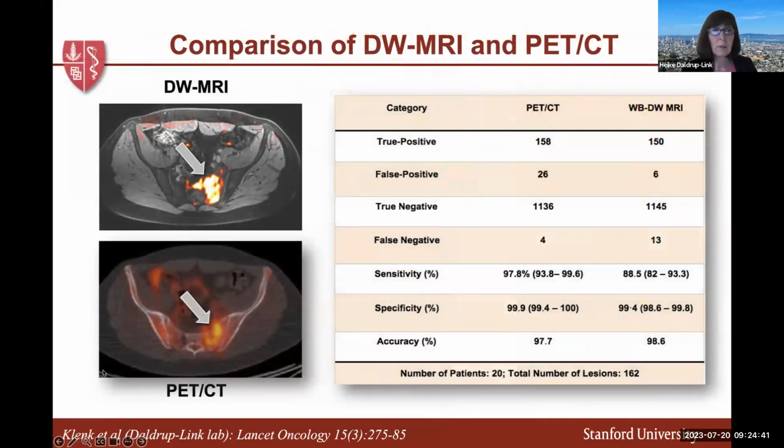We did a study some time ago where we compared the sensitivity of these integrated diffusion weighted scans with PET-CT, and we found similar sensitivity and specificities for PET-CT and whole body diffusion weighted MRI.